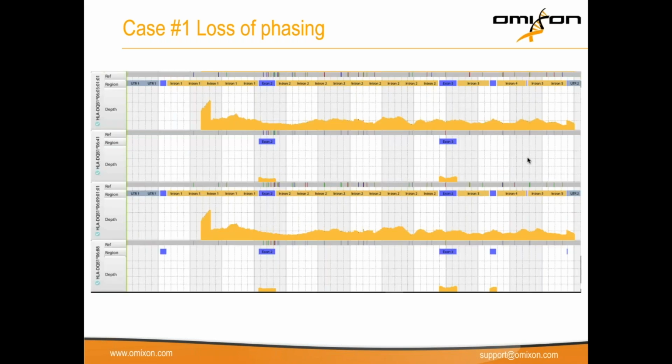So let's come back to investigate our DQB1 result and answer why the result is ambiguous. We must compare both allele pairs in the genome browser. We can see that alleles 0641 and 0688 are not fully defined in the IMGT database, so we can use only exons to distinguish them from the other allele pair.